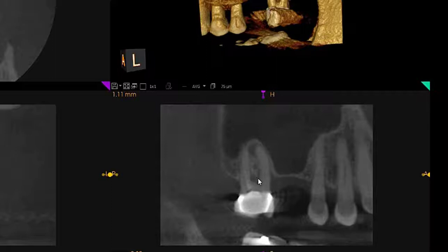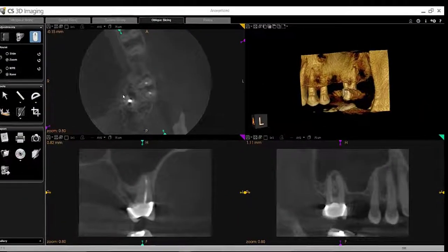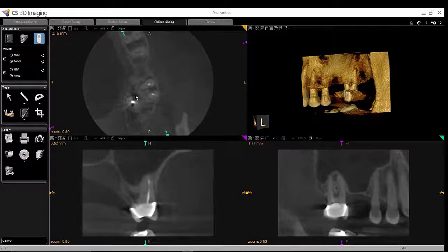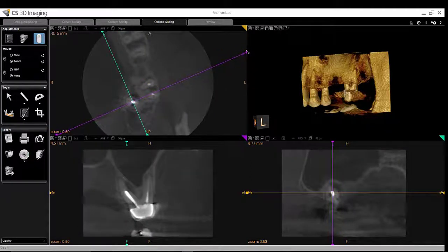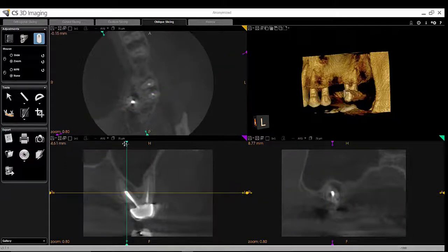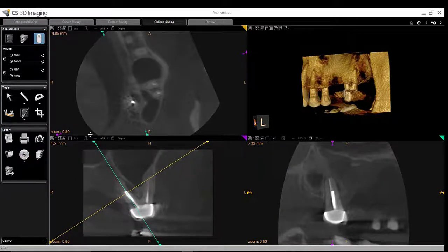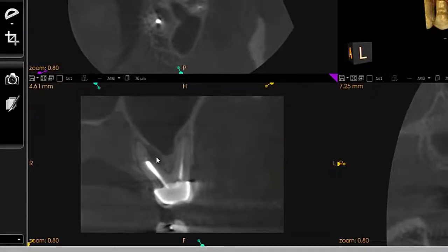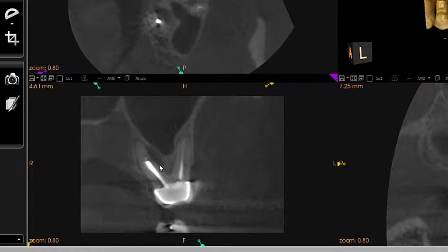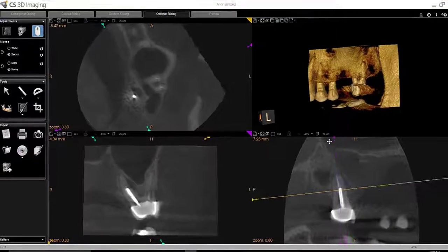I also see a focal radiolucency in this view. Looking at the axial slice, the palatal root has a radiolucency. Examining it more closely, and aligning the slice along the long axis of the palatal root, just where the post meets the gutta-percha, there is a linear radiolucency, which may suggest that this root is developing a fracture — especially given the patient's history of parafunction and PTSD.